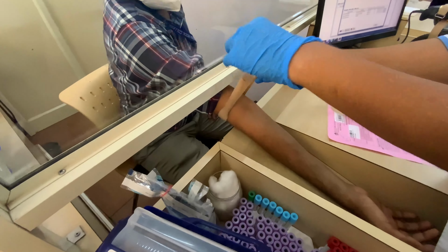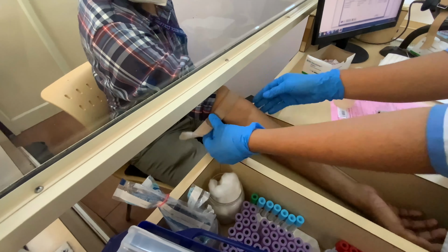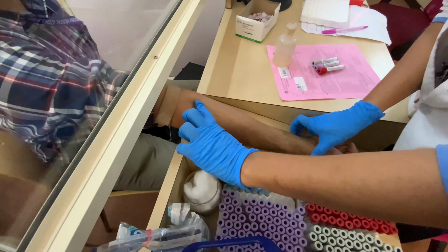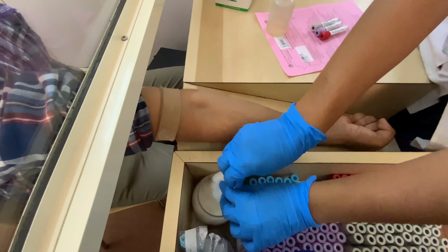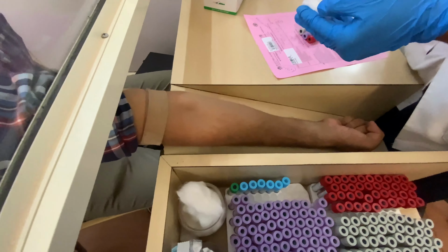For drawing of blood, the tourniquet is tied above the vein of interest to occlude the blood flow, the vein of interest commonly being the medial cubital vein. The area is then cleaned with rubbing alcohol and allowed to dry.